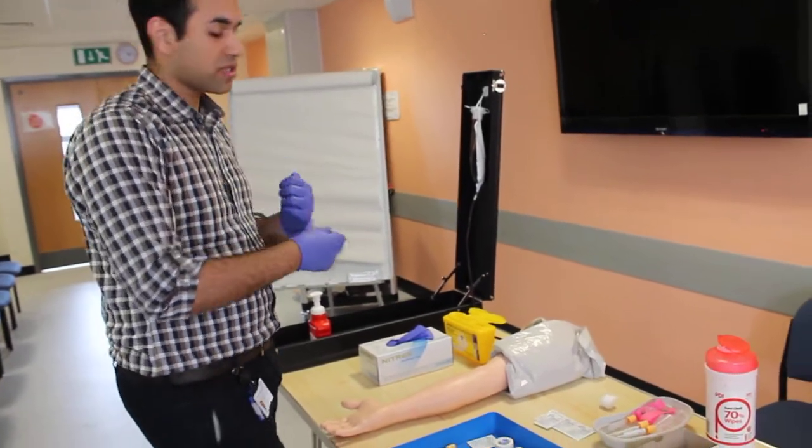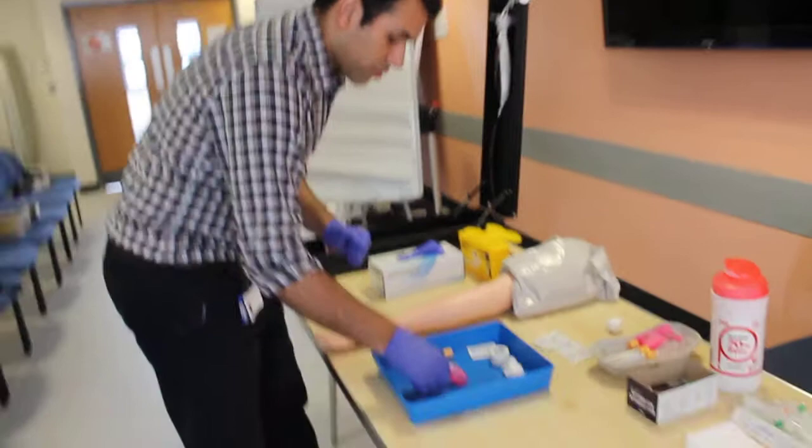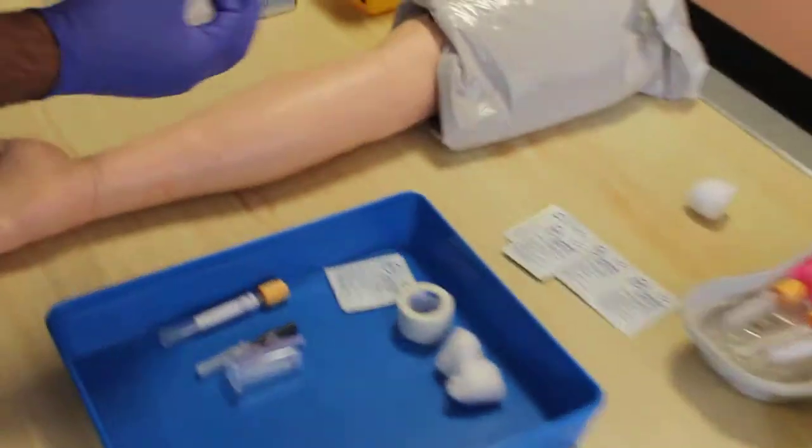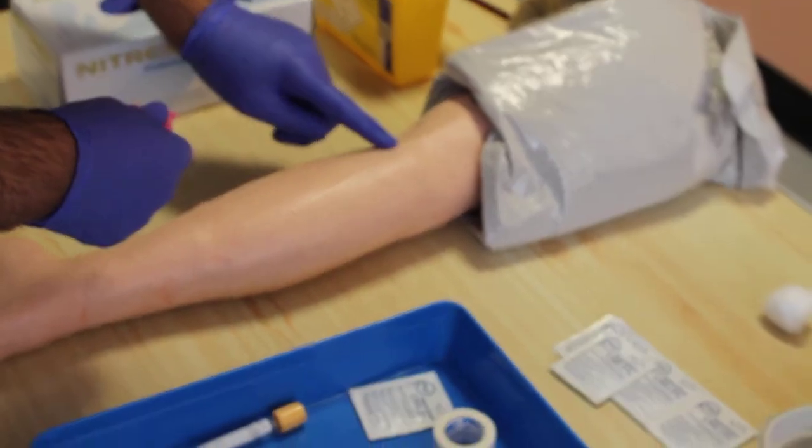After greeting the patient and explaining the procedure, you go ahead with performing it. The first thing you need to do is see if there's a good vein on the arm. There's one over here.